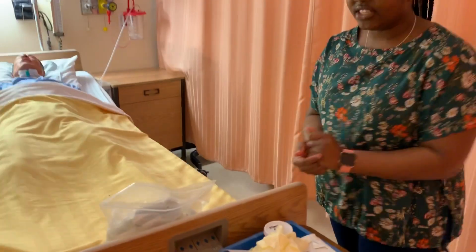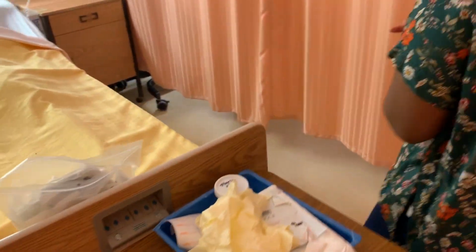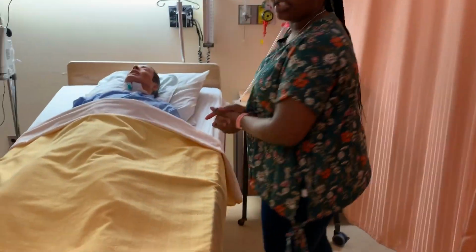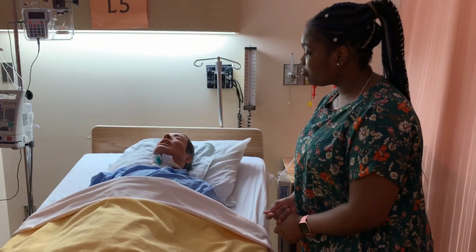I'm doing my hand hygiene. And then I would check again for his vital signs. I'm doing hand hygiene. I'm introducing myself to the patient. My patient is not in any distress. Oh hi, I'm Chima. I'm the student nurse, and I'm gonna be doing a chest tube dressing today.